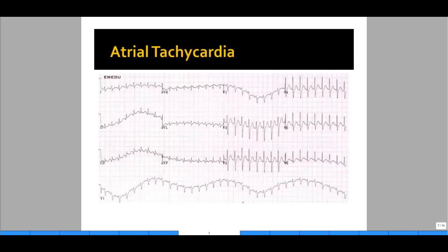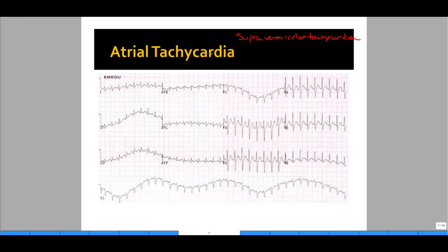Let's take a look at atrial tachycardia, which is very important to identify. Like before, you want to know whether there's a P wave for every QRS and whether it's narrow or wide complex QRS. In atrial tachycardia — otherwise known as supraventricular tachycardia — it's sometimes difficult to identify the P waves, but you can identify the narrow complex QRS, which tells you the rhythm is coming from above the ventricles. If you see a patient with this in the hospital, the first thing you want to do is get vitals. If they do not break out of the rhythm themselves, you need to consider giving them adenosine to hopefully break out of supraventricular tachycardia.